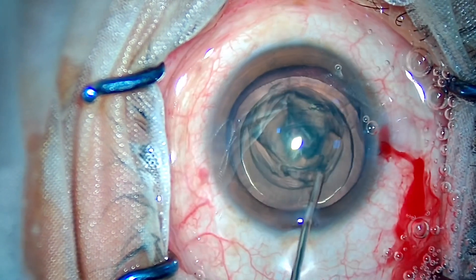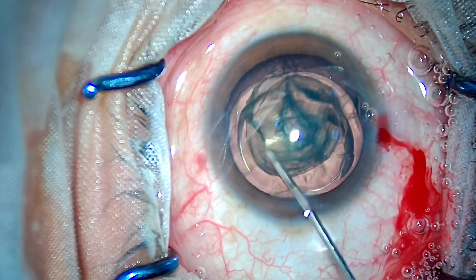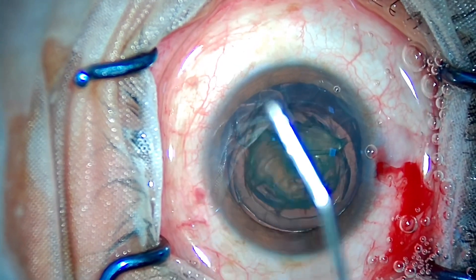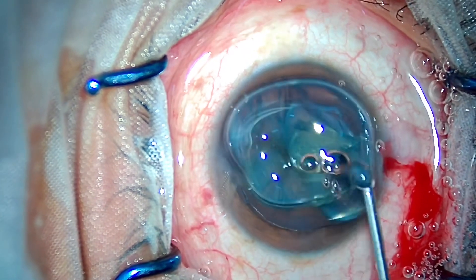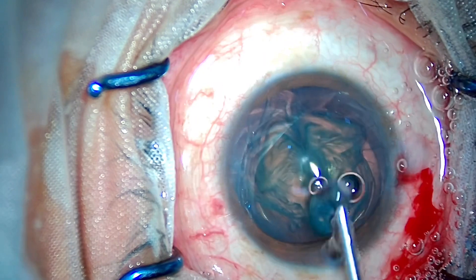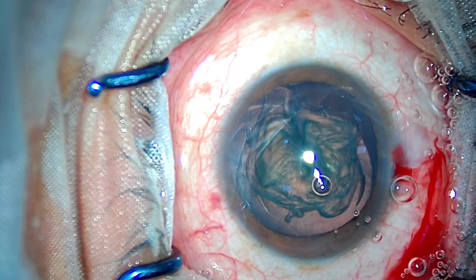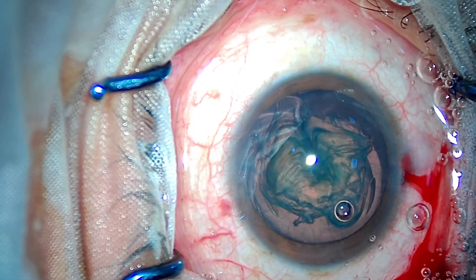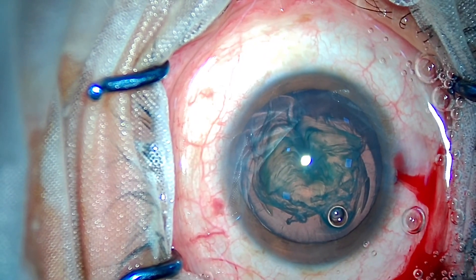You can see these beautiful hydro-delineation waves and hydro-dissection waves causing the nucleus to just bulge out of the bag. The consistency is very, very soft — it's like the consistency of curd, if I can draw that homology.